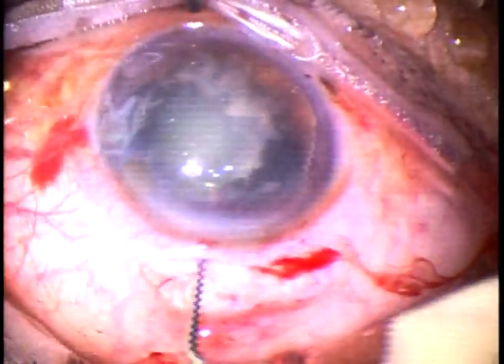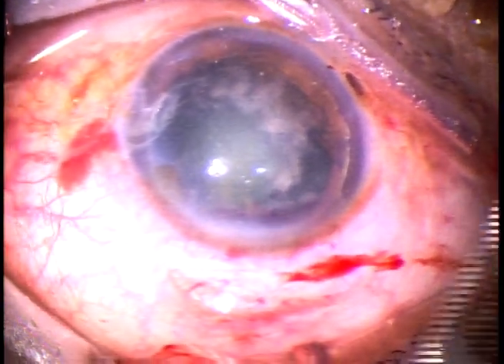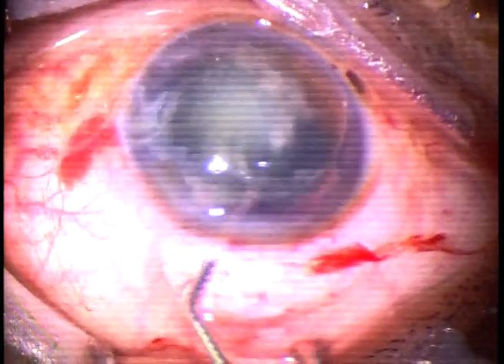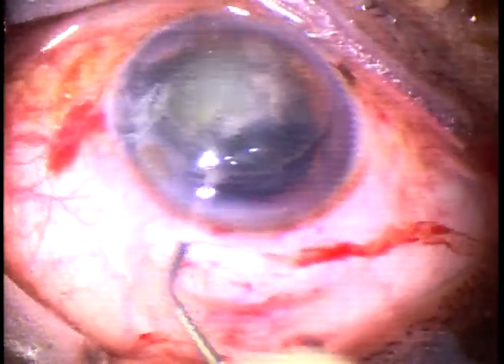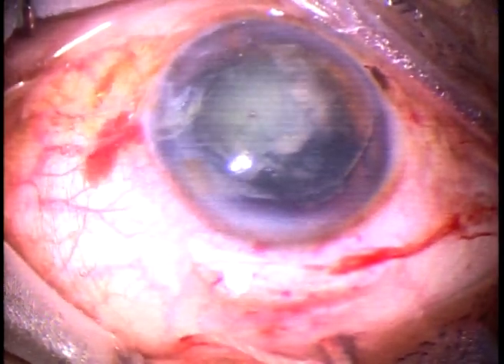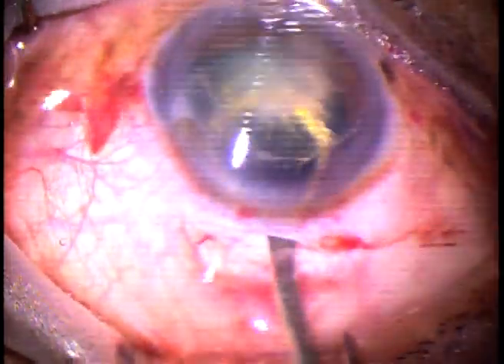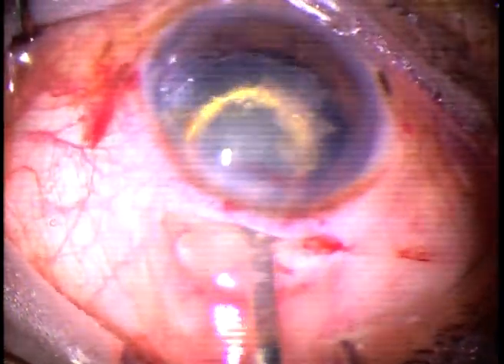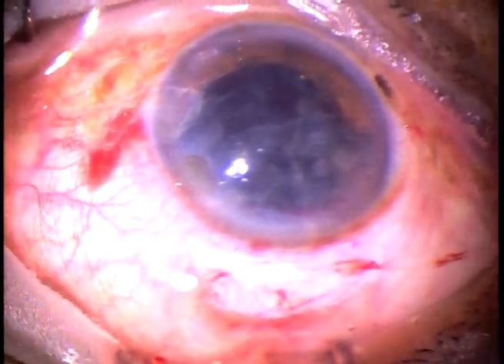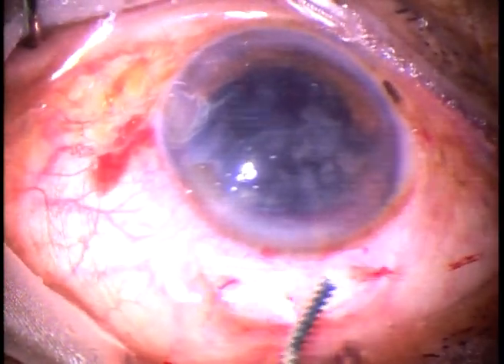The nucleus is rotated — in this case, anticlockwise; sometimes both clockwise and anticlockwise — to prolapse the nucleus out of the capsular bag. Viscoelastic is injected both in front and behind the lens mass to protect the cornea and to place the posterior capsule far behind. This is the irrigating vectis — it goes and brings the lens out. There is a lot of epinucleus remaining in the anterior chamber.